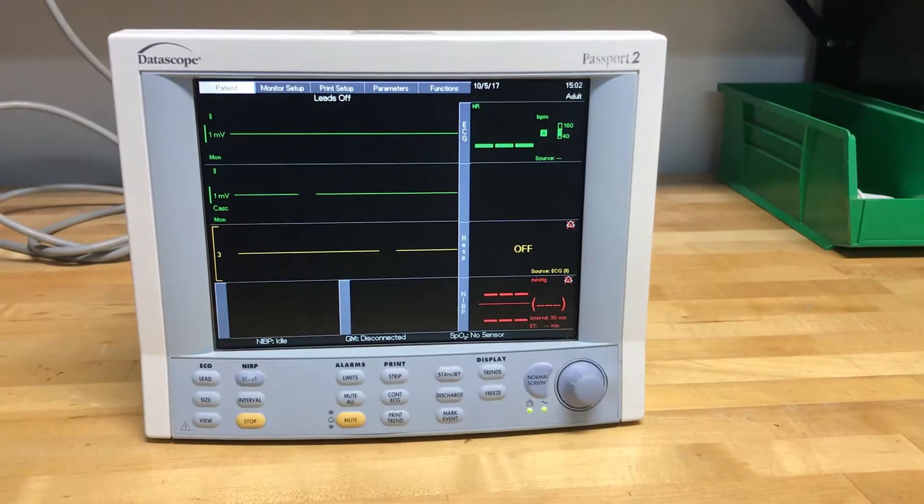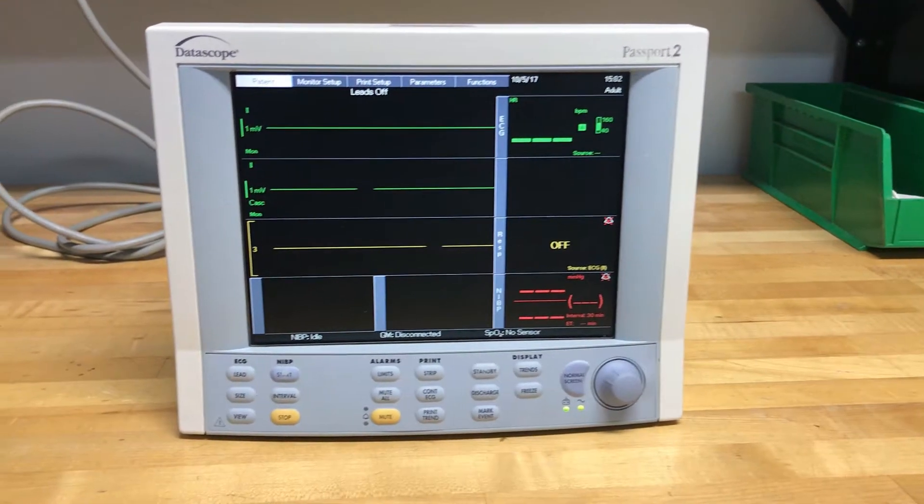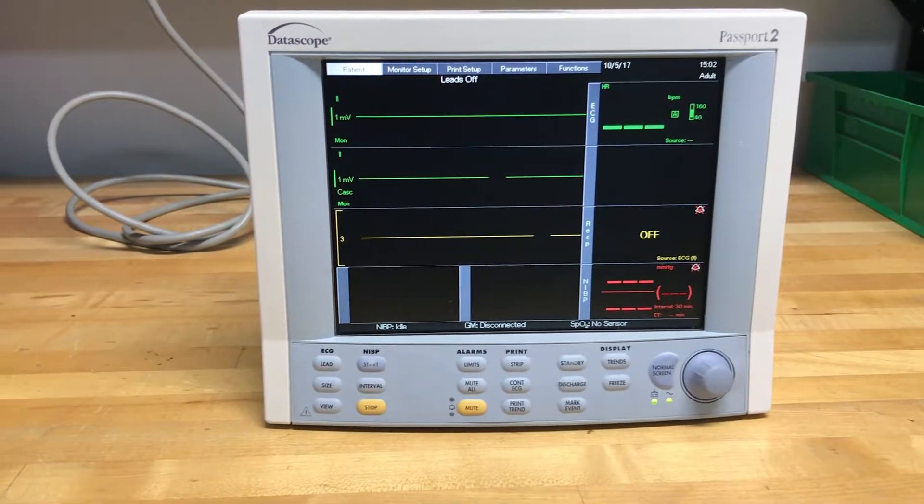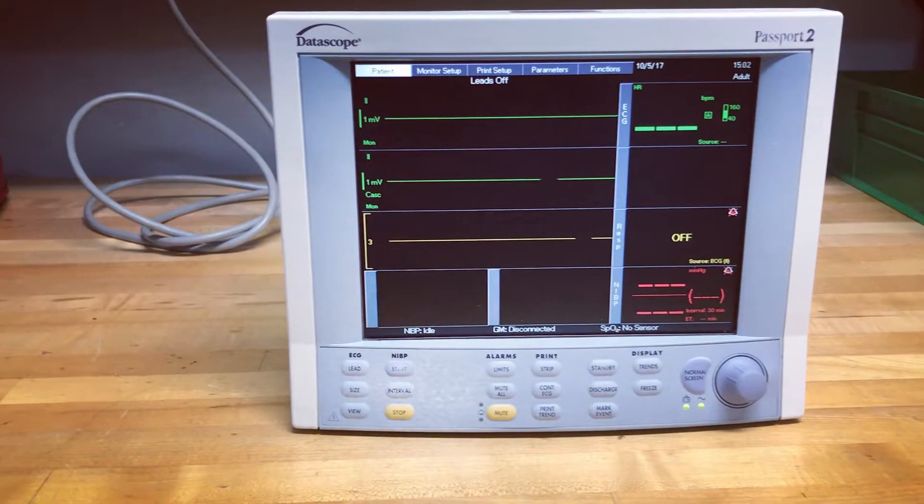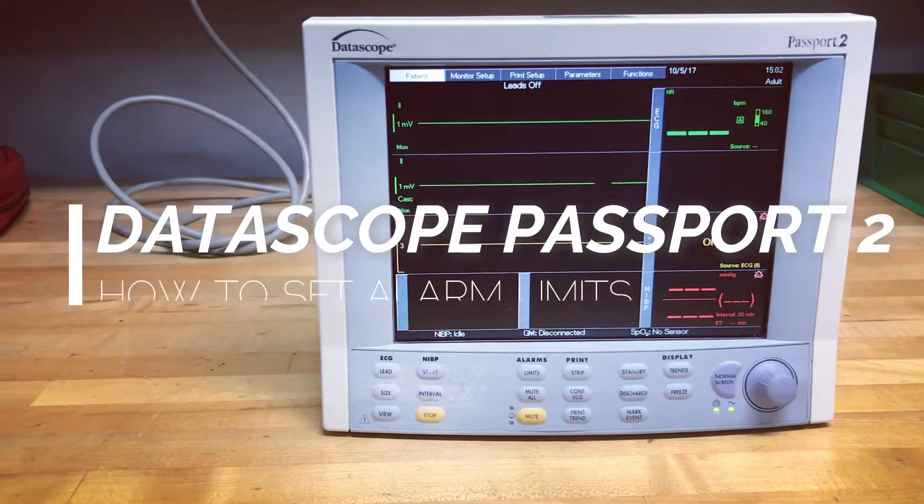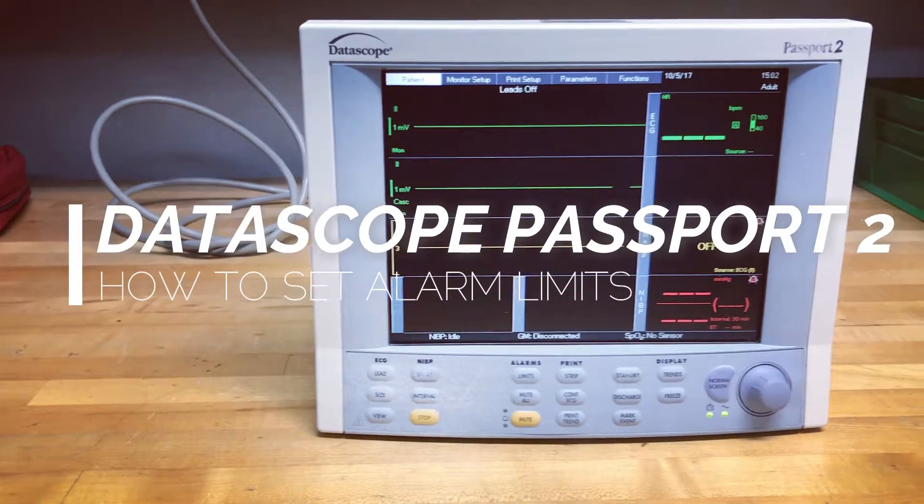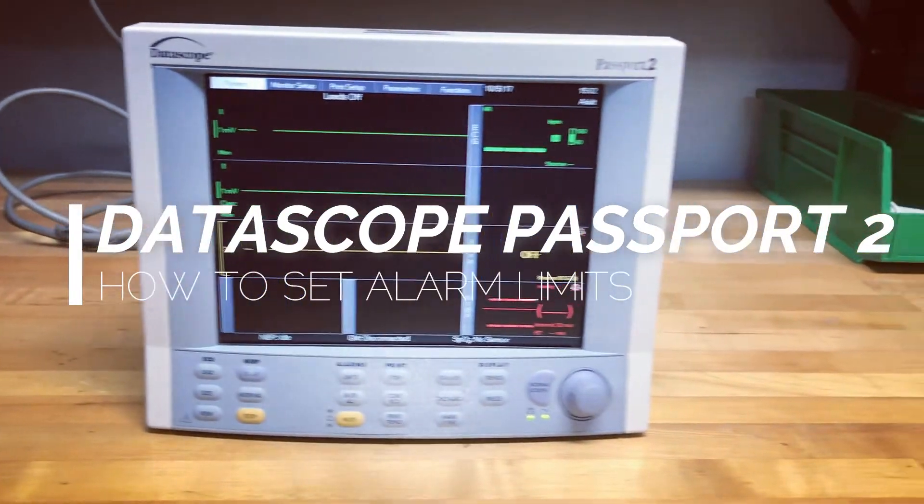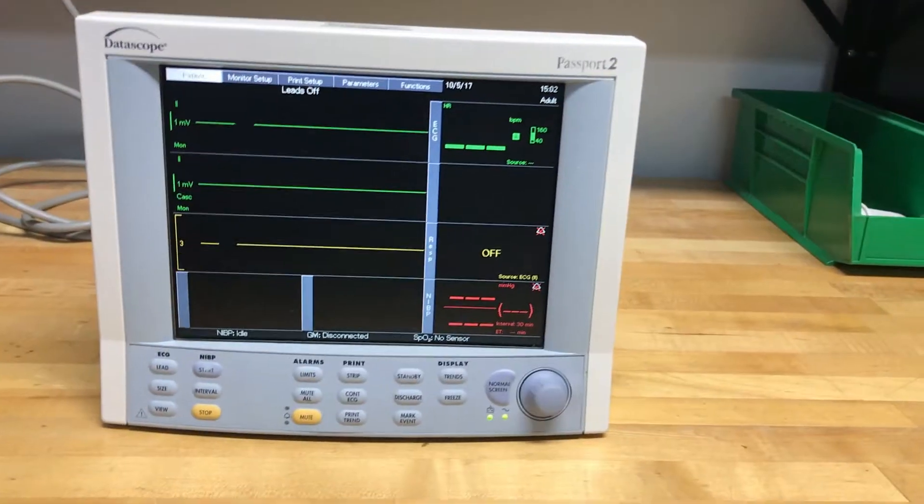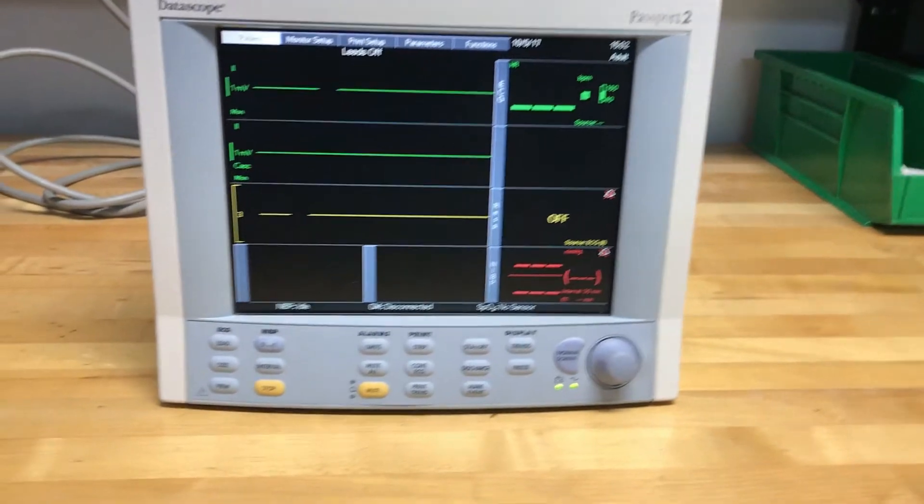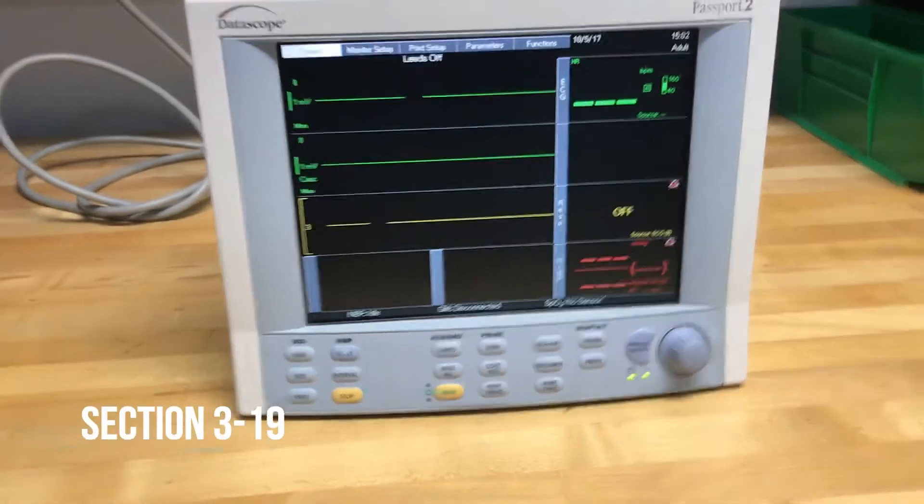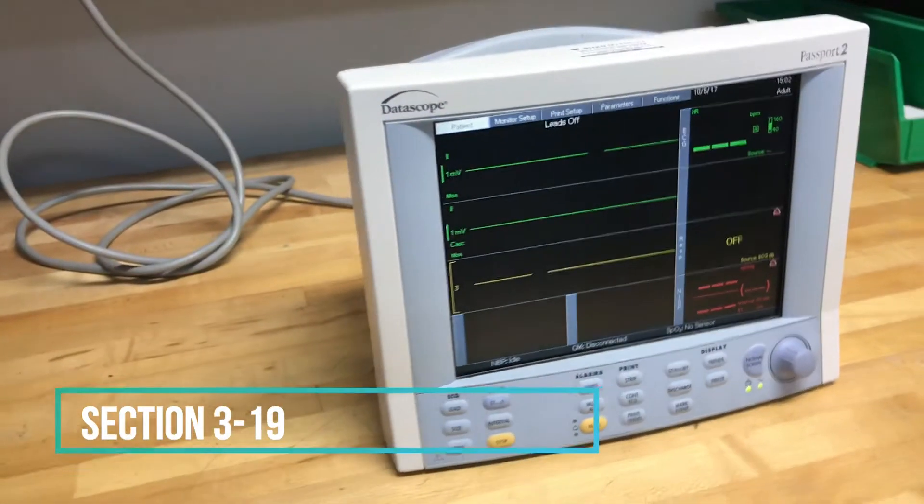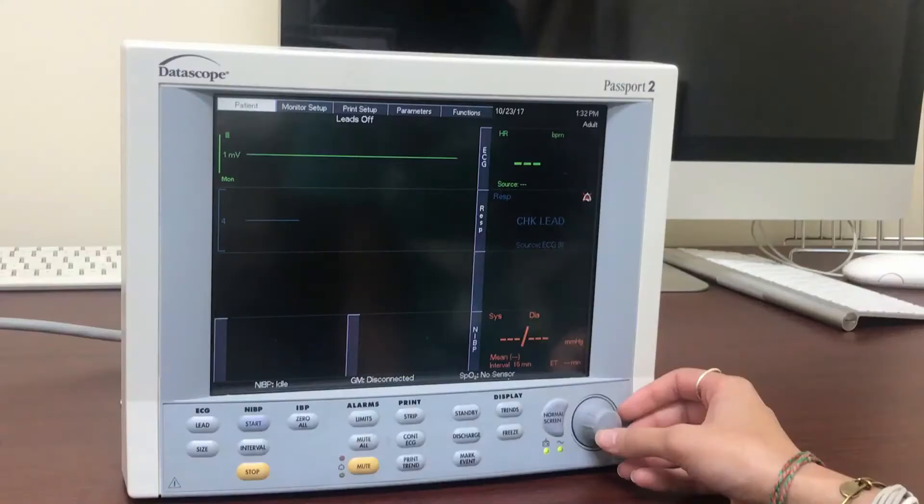Hi everyone, this is Mahira from OXO Medical. Today, we will be showing you how to set alarm limits on the Datascope Passport 2 monitor. How to set and change alarm limits can also be found under section 3-19 in your Passport 2 user manual.